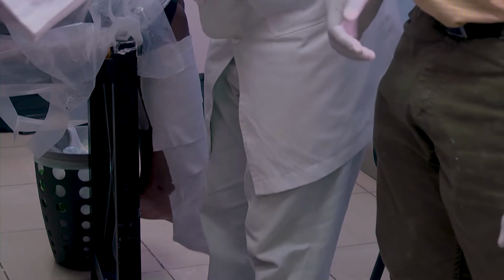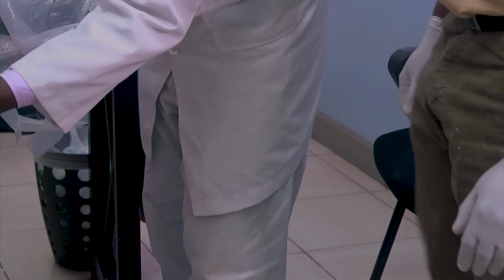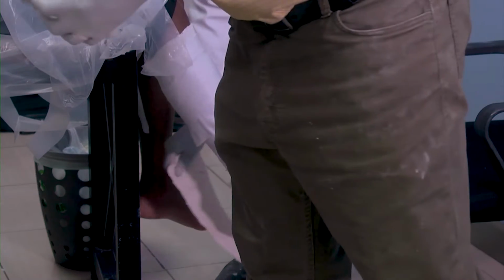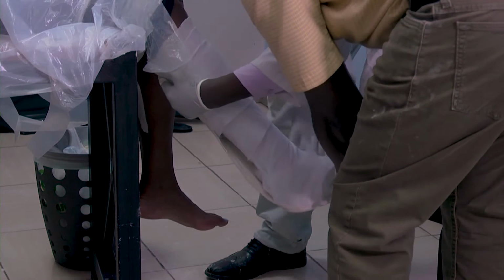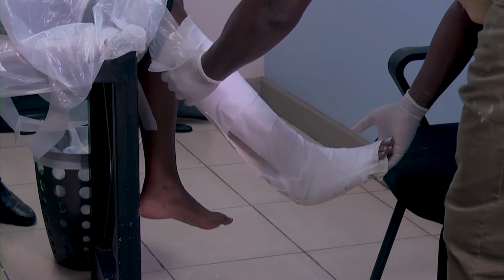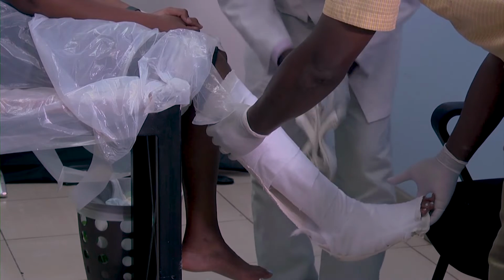Make sure that you are dipping it. When you're applying it to the lower limb, you can apply 8 layers or even 10 layers, because you need to give stability, so give 8 to 10 layers. So let's dip it. Because I have my assistant, thank you. This procedure, you cannot do it alone. You always require 2 personnel, or sometimes even 3.